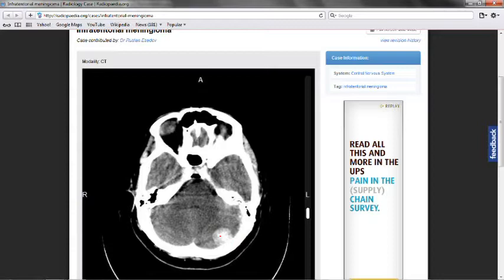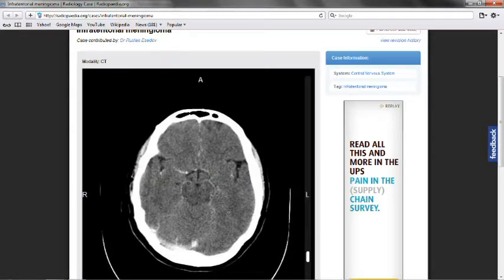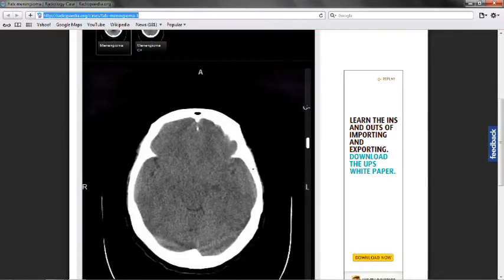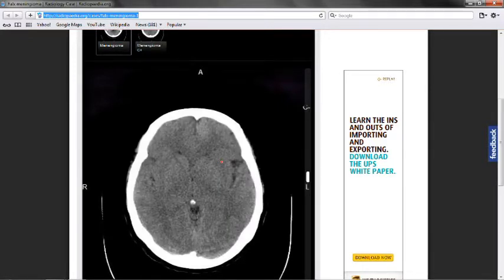So this is typically what you're going to look for in a meningioma. Hyperintense, with increasing hyperdensity based on the injection of contrast. And as we can see, we have this circular bulbous mass holding the contrast in, and we see that this has contrast as well. So very characteristic of a meningioma. So here is our second slide that has images on it. So go ahead and click that link as well, and it'll bring up this. It's a falx meningioma. And so, judging by the name, the falx meningioma, it's probably going to be on the falx cerebri.